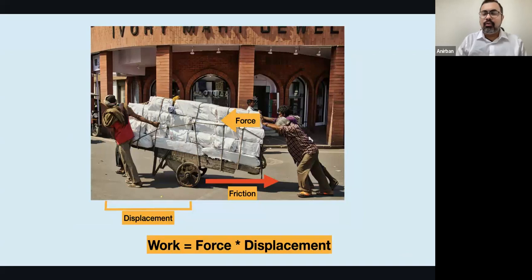So yes, we know that the ventilator is a machine that does some work against some forces. If we draw the analogy, it is like somebody pushing a cart. While somebody is pushing a very heavy cart, he is doing some work to move the cart against the weight of the cart, right? There is a force which prevents the cart from being moved from one place to another, and if you are moving the cart, you are doing work against that force. So you do work only against some force.